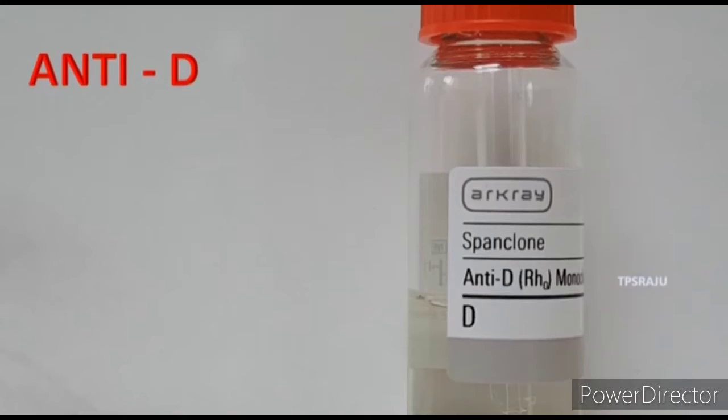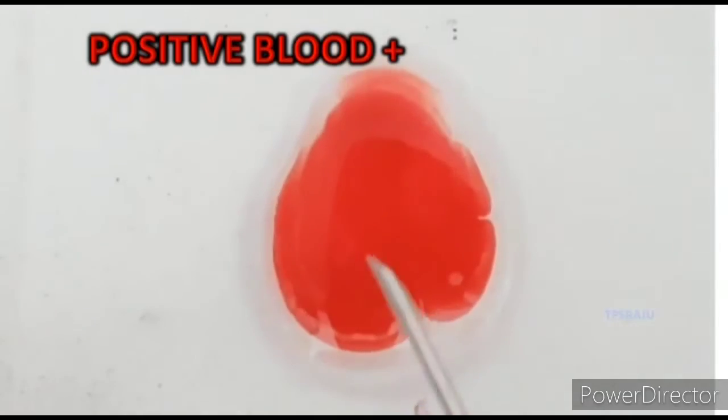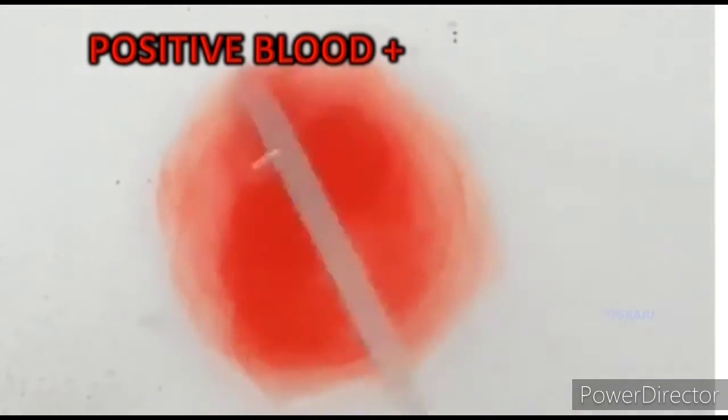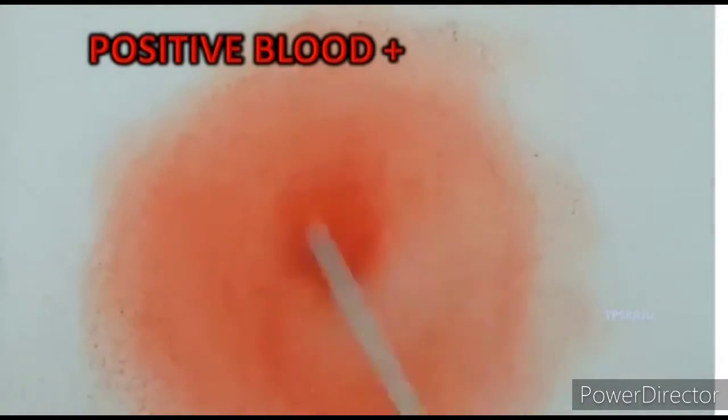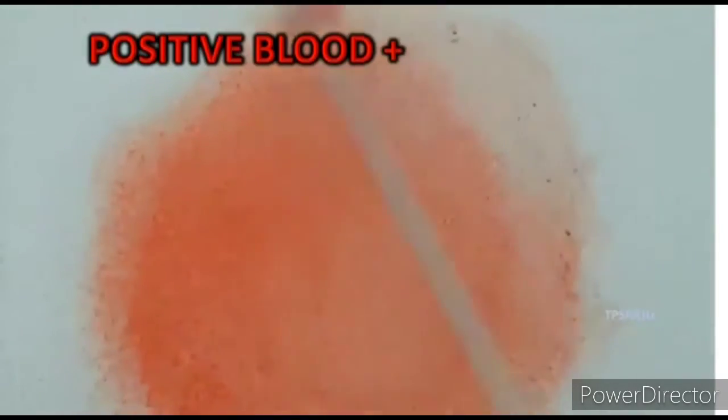So, if we have to know whether the blood is positive or negative, take one drop and put one drop of blood into that serum. If it agglutinates, then it is positive. It is a slow process and it will take some time to give the result. We have to wait for some time. Here the blood sample which was taken is agglutinating. So the given sample's RH factor is positive.